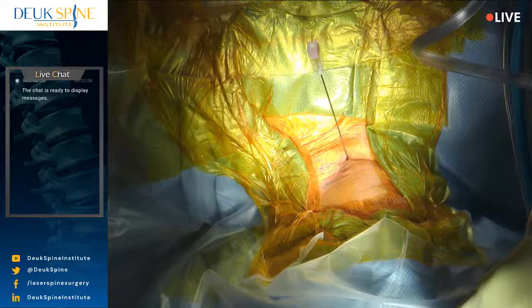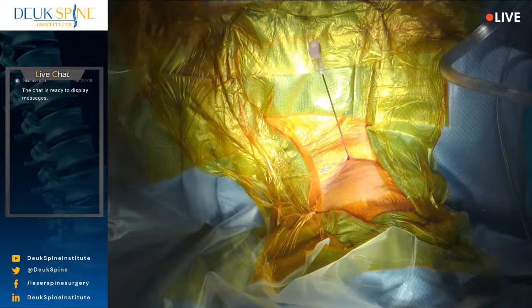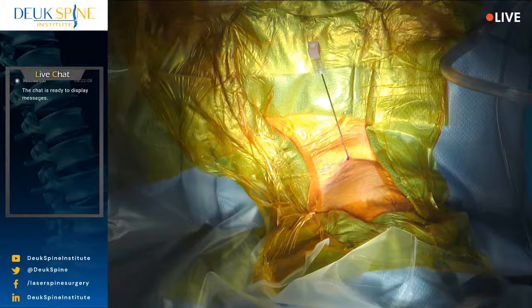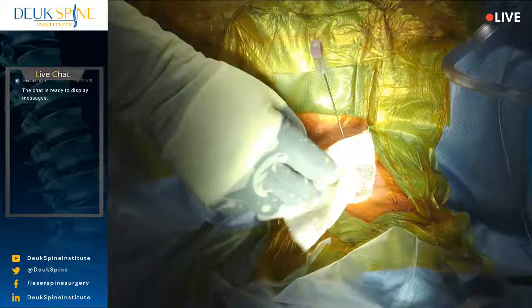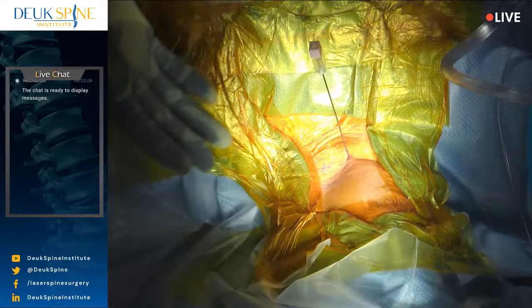All right, good. Our patient's blood pressure is good. Let's try to keep it a little bit lower. I like to keep the systolic from 90 to 110, and right now we're at about 125, which is normal, but I like to have it a little bit lower. My patient is completely chemically paralyzed, meaning we've used a muscle relaxer to make her muscles relax. That way I can feel the spine through the front without the muscles around the trachea and esophagus contracting.